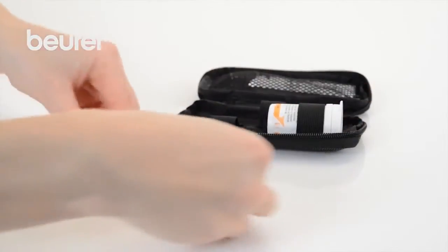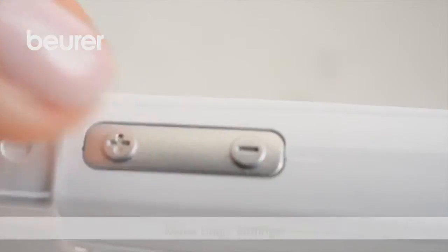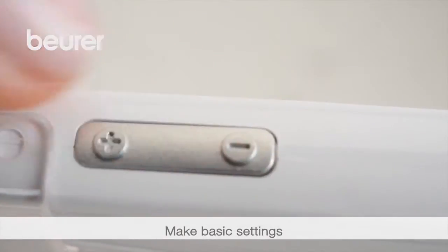Remove the battery insulating strip. Use the plus and minus buttons to set the year, then press on-off to confirm the setting.